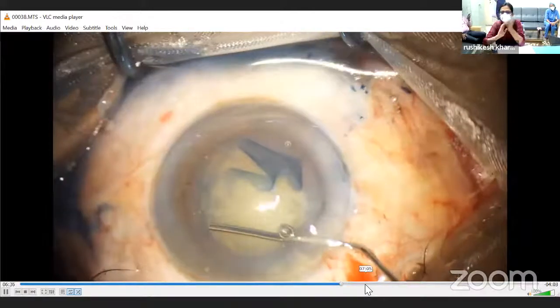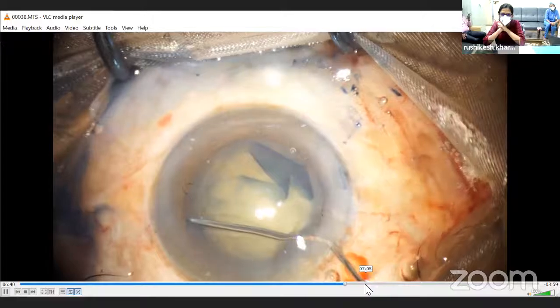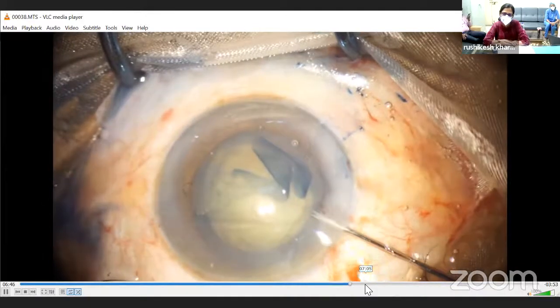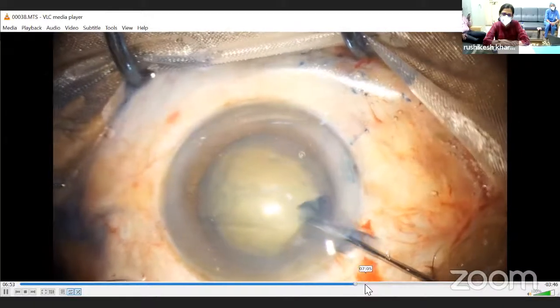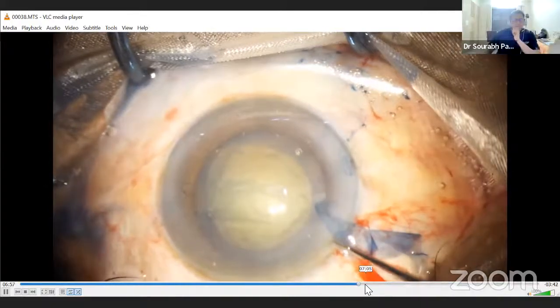After this, I attempted hydrodissection.